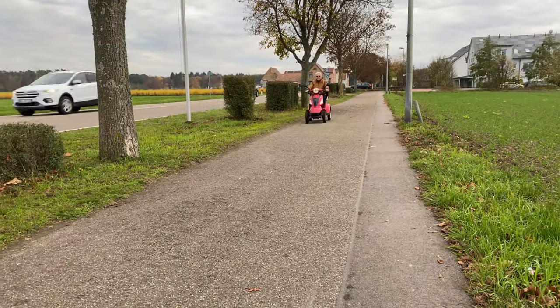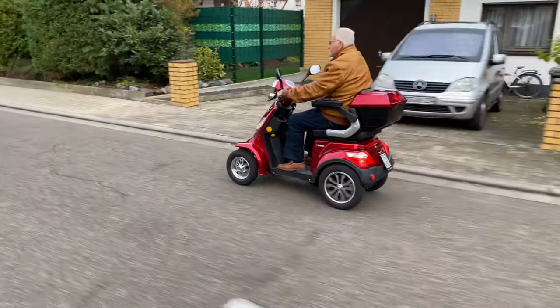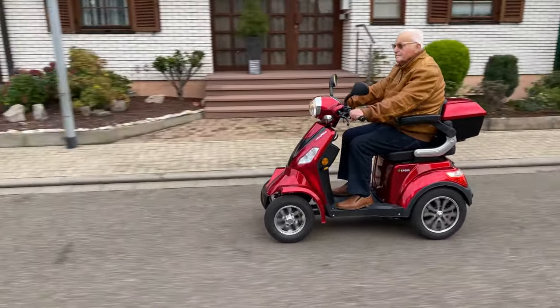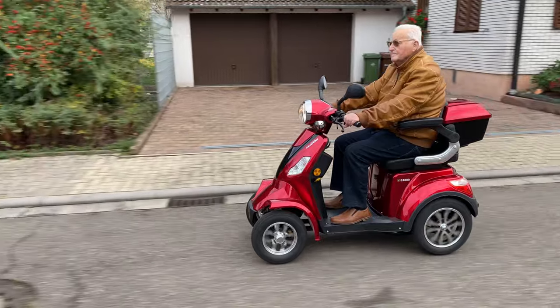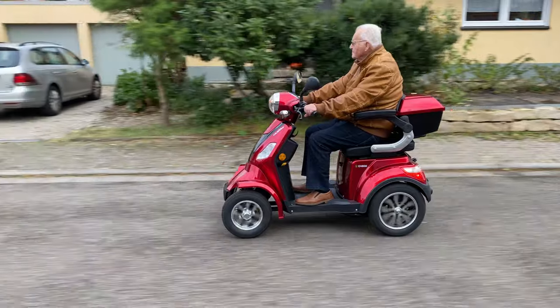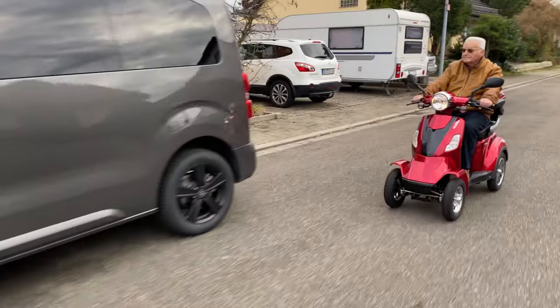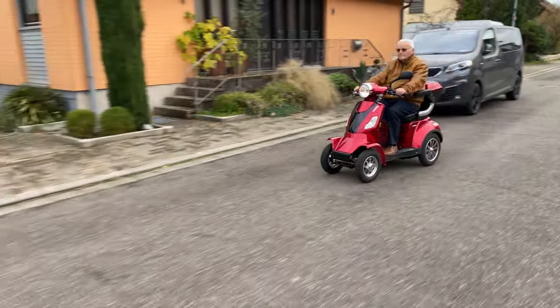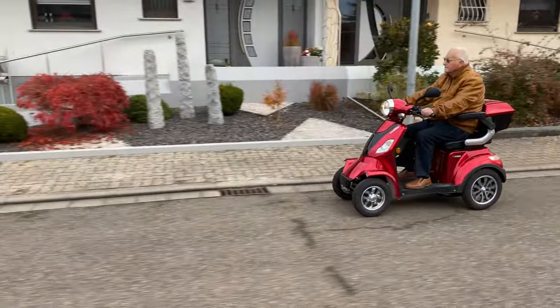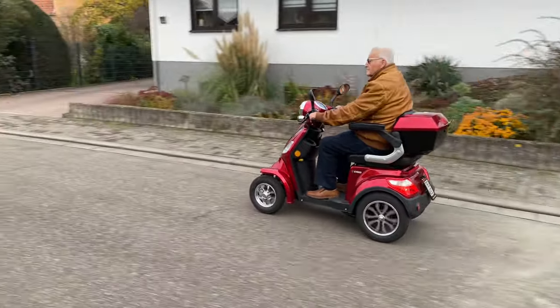If you want to buy a mobility scooter, you should also pay attention to the range of the battery. This can range from around 15 to around 60 kilometers — the greater the maximum range, the less often the mobility scooter needs to be charged. A range of around 50 kilometers can be achieved by the Luxon. The lead-gel battery works with 60 volts and 20 amp-hours. The charging time is about six to eight hours with an empty battery.